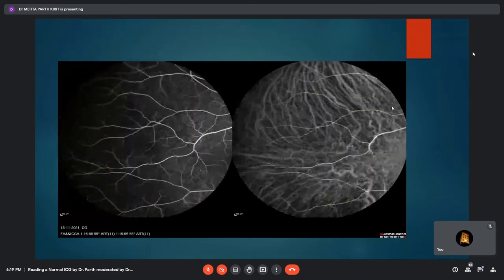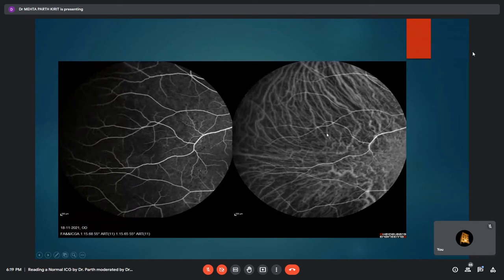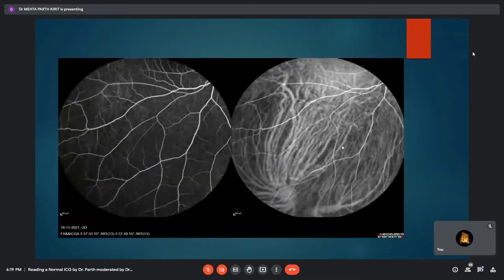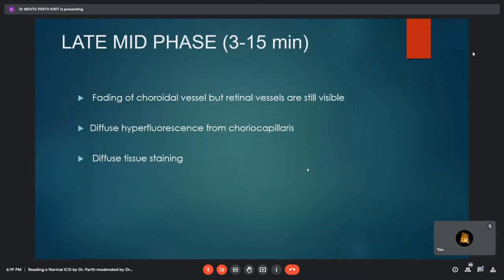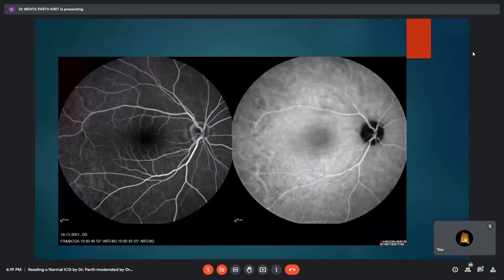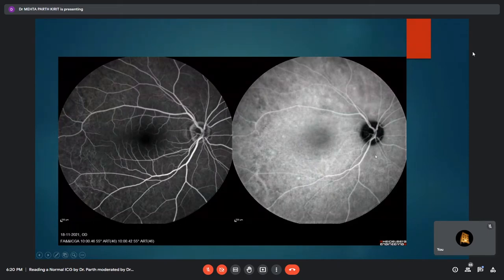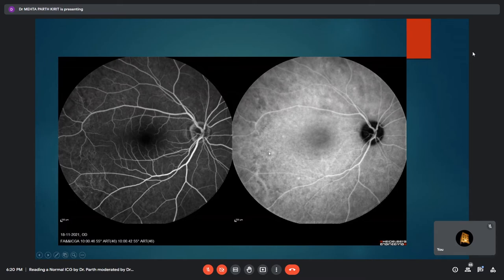In the early mid-phase, quadrant examination is performed to look for any pathology, including filling of the vortex vein in the periphery. In the late mid-phase, lasting 3 to 15 minutes, there is gradual fading of the choroidal vessels while retinal vessels remain visible. There is diffuse hyperfluorescence from the choriocapillaries and diffuse tissue staining. All choroidal vessels seen prominently in earlier phases have now gradually faded, while retinal veins and arteries remain prominent.